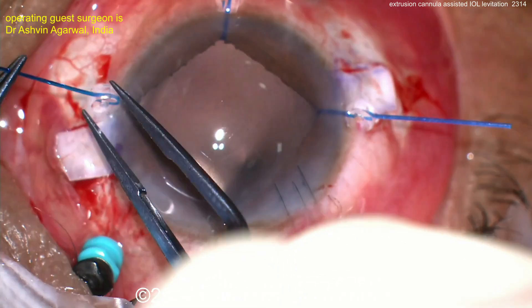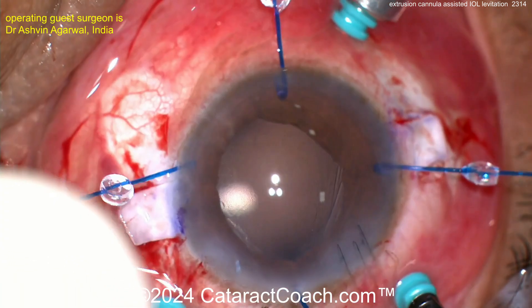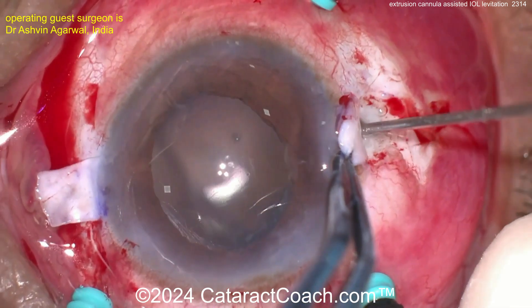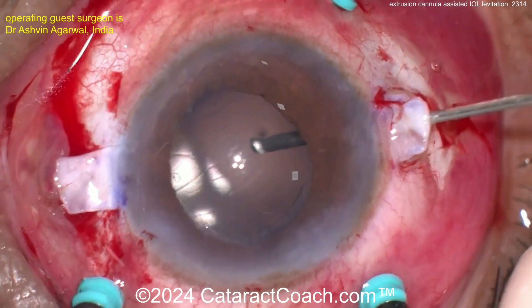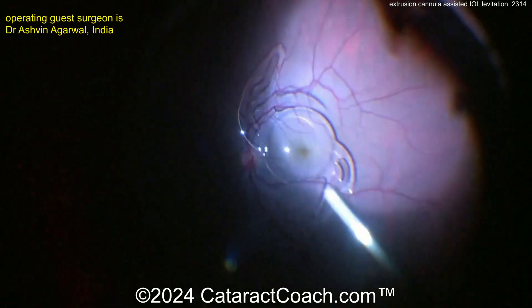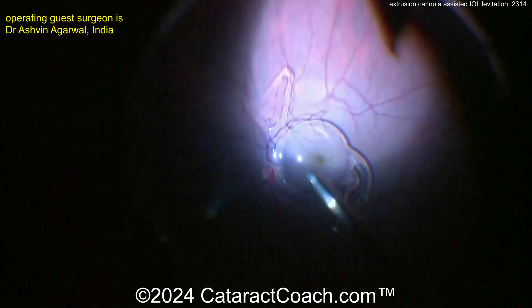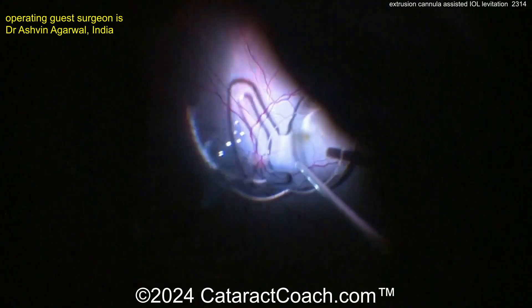Once you get the vitreous out and the lens is no longer entangled with it, you need to get it out of the eye. Iris hooks coming out. We're going to go back inside with the vitrectomy cutter, making sure there's no more vitreous. That lens obviously does not belong on the macula and cannot be done with the glued IOL technique while still back there.